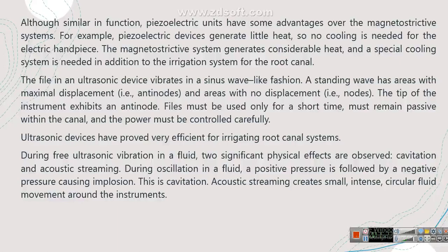And when we insert the ultrasonic within the canal system, some sort of acoustic streaming could be very intense, and the movement of the fluid around the instrument could be found.